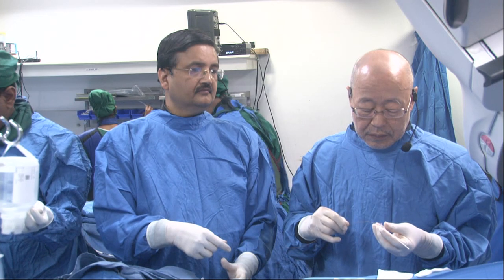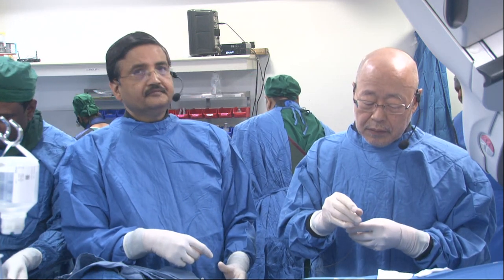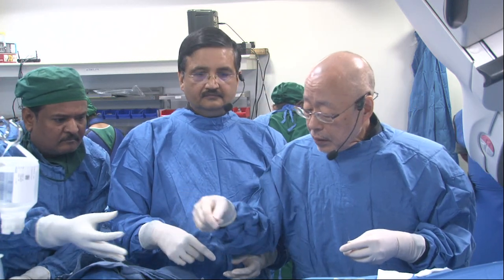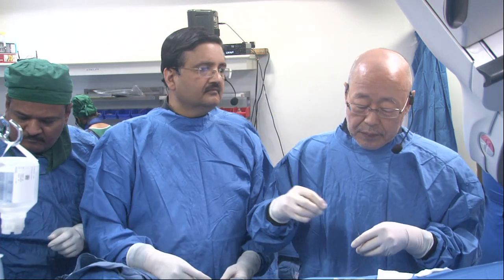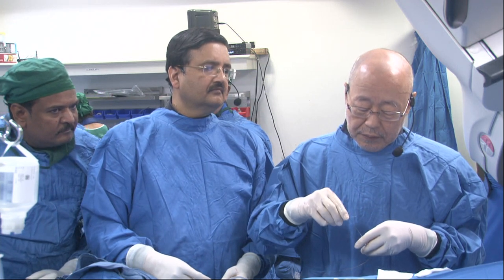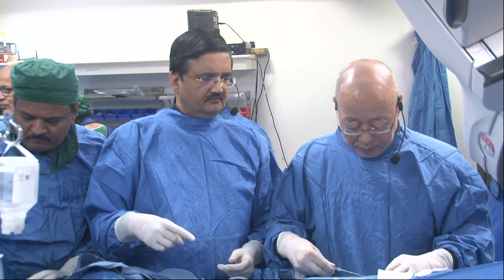Which is why when I planned the case at the beginning, if I had imaged this early on before stenting, I probably would have, and this goes to Dr. Katie's point, right? Had we imaged at the beginning, I think I would have probably planned to stent from left main into LAD in the first place. And then we would not have been discussing the issue of should we dilate proximally or not? Is there a danger to doing that or not? Because the answer is we would have stented already.